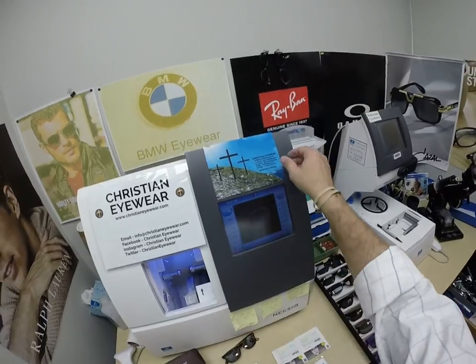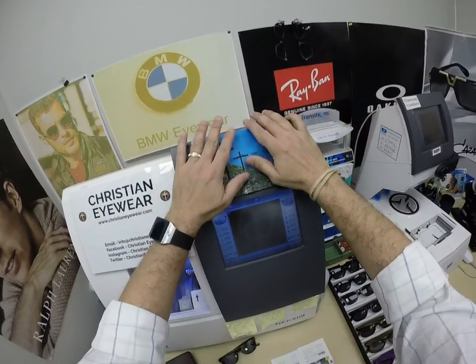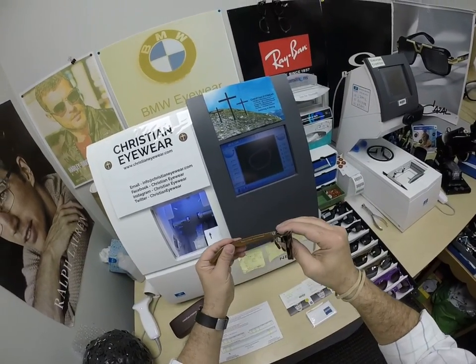It comes with the hard shell case. You're going to get our Christian Eyewear cleaning cloth with all our social media on there. But this is what everyone came to see.